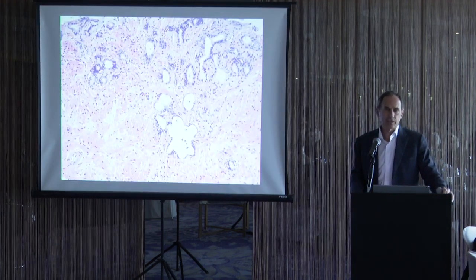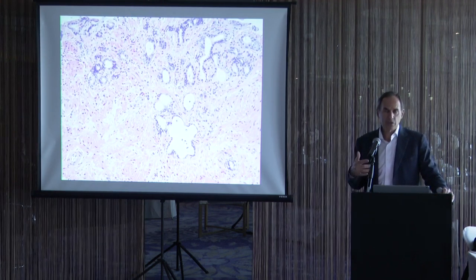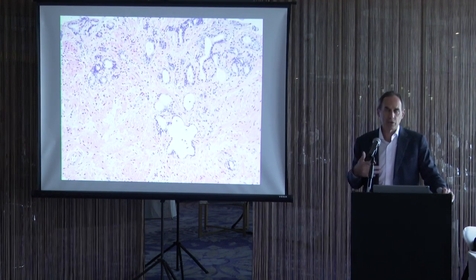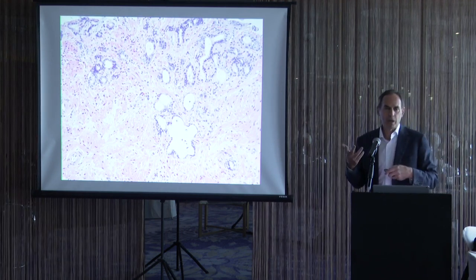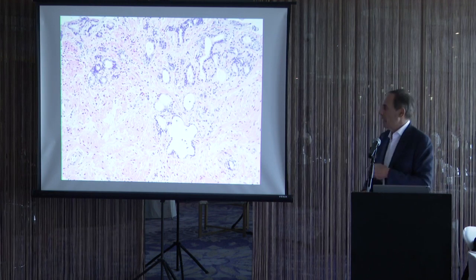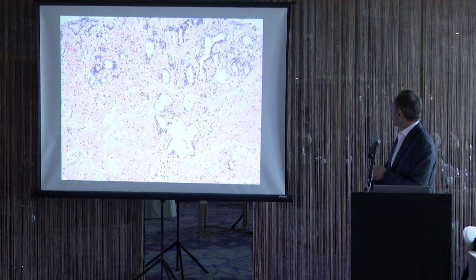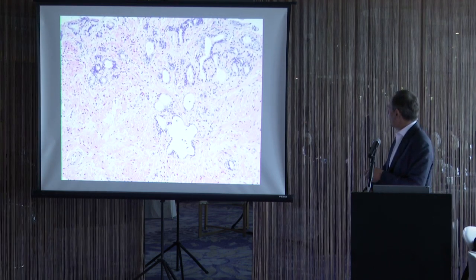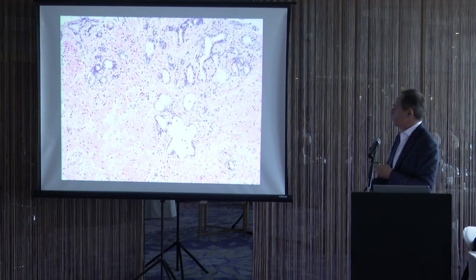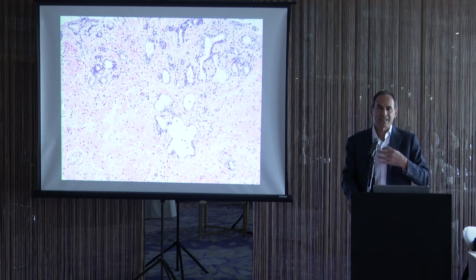One is atrophy. And there's several different patterns of atrophy. One pattern is called post-atrophic hyperplasia, or PAH. And those are glands that look very blue at low power. And the reason why they look blue at low power is you're basically only seeing the nuclear outline of the gland. There's very little cytoplasm apically, very little cytoplasm between the nuclei. So all you're really seeing at low power are nuclei, and that's why it looks blue. And you can diagnose post-atrophic hyperplasia at scanning magnification.